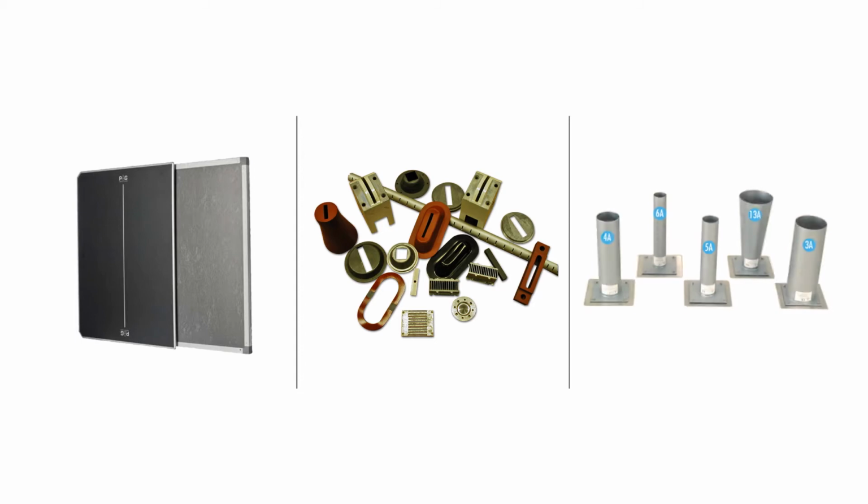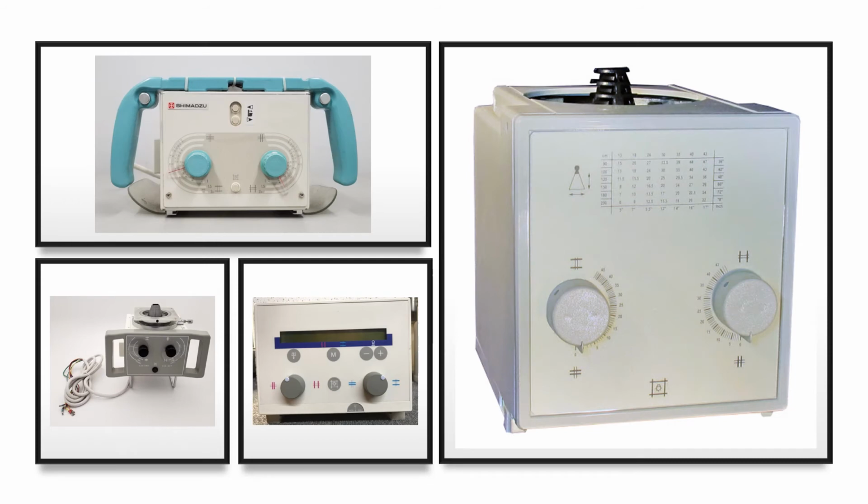A cone or cylinder is anything we attach to the bottom of the collimator housing to help focus the X-ray beam. You see these often in dental offices. However, the most common beam restrictors are the variable aperture collimators. They come in many different designs, but they all do the same thing: limit the size of the X-ray beam.